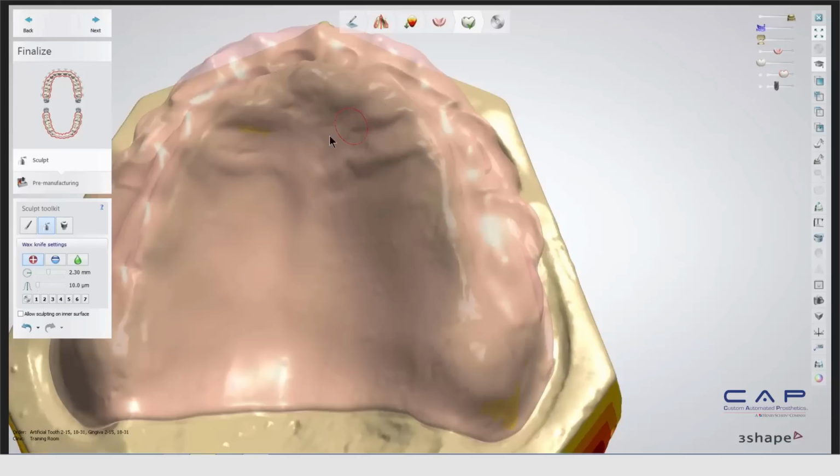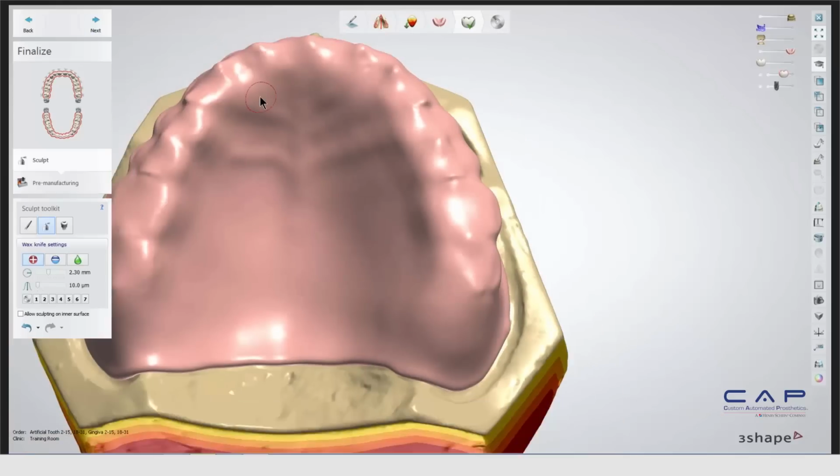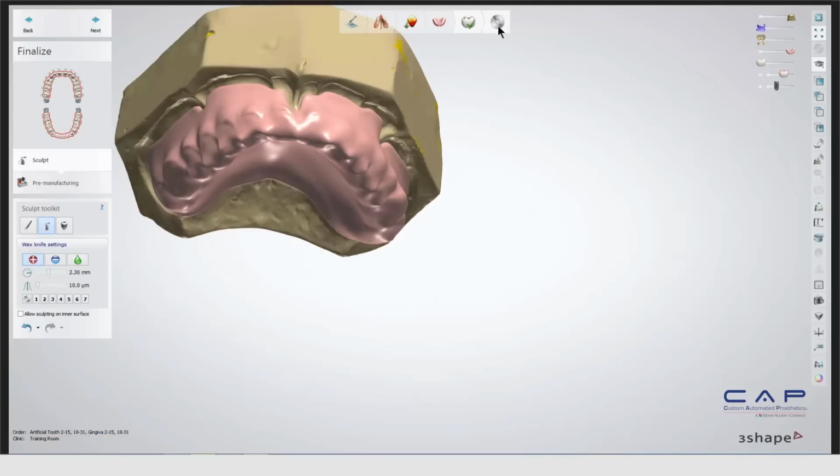Another thing you could do is develop your own library for a wax up. If you want to spend a lot of time waxing up one denture by hand, an upper and a lower, you could put that in and create a standard wax up for your own laboratory. It's a really great thing to do. The wax up falls into your denture with just the push of one button, so all the energy you put into creating that library is well worth it. And in fact, Armand Gerbeck has developed a beautiful library for their wax up.